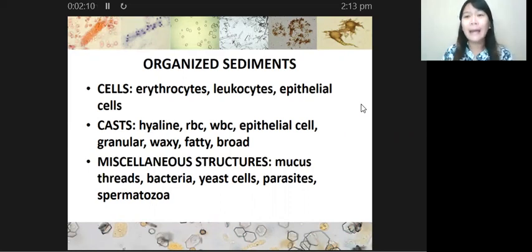And so, para mas effective ang ating pag-aaral at para, syempre, matandaan natin agad-agad sa exam, or pag tinanong tayo, i-memorize mo lang yung unorganized. Kasi the others naman, iisa lang sila, puro organized naman yung iba. Nakuha, basta alam lang natin na si unorganized, mag-isa lang yan, si crystals lang yan. Okay? So unorganized, crystals lang po. All the other sediments are classified under your organized sediments.